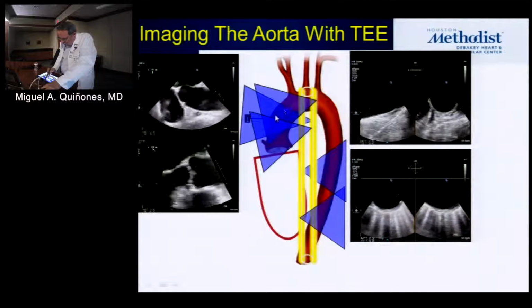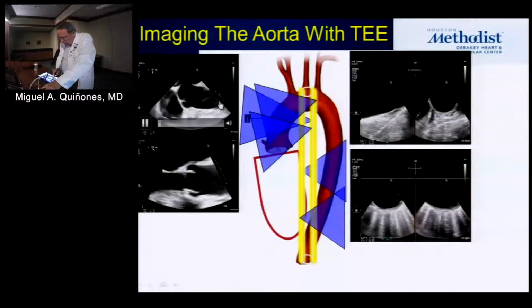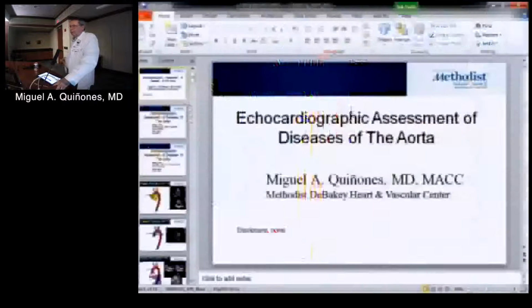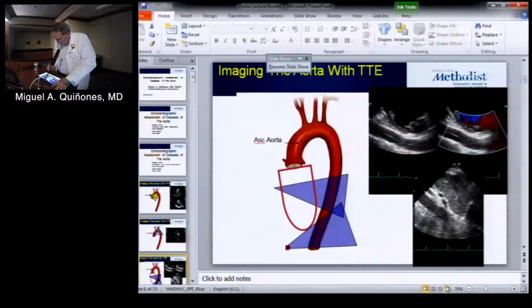So this gets us back to some spot around here that either between not being able to reach it using the 100 degrees or not being able to reach it from coming back into the aorta, we might miss. And how the heck did I do that?